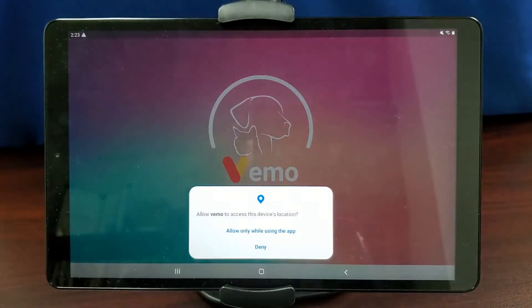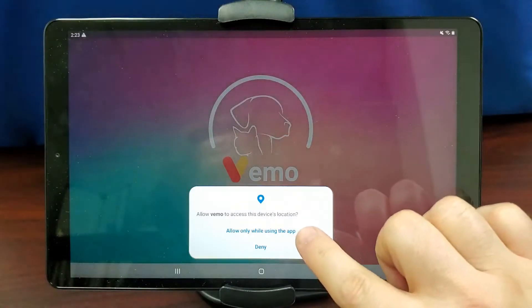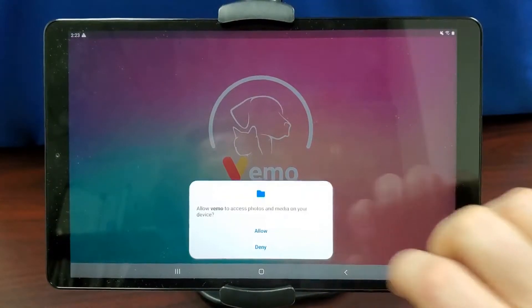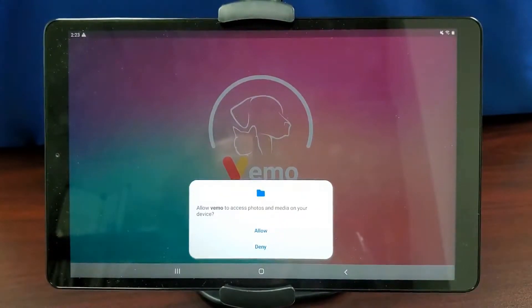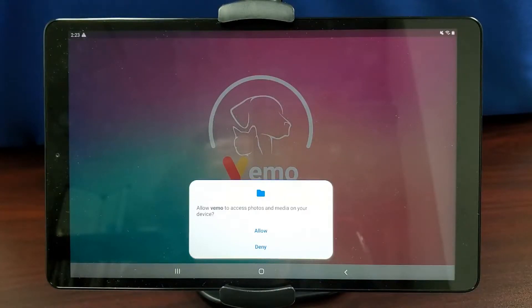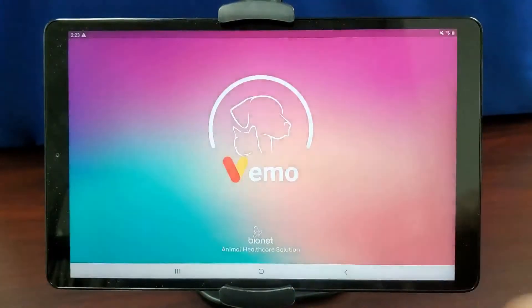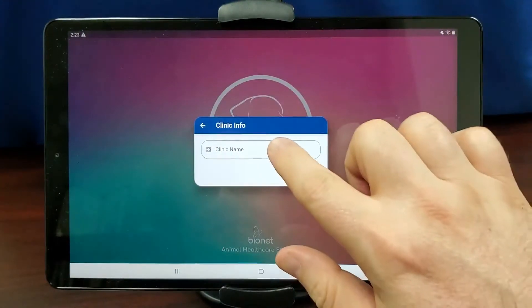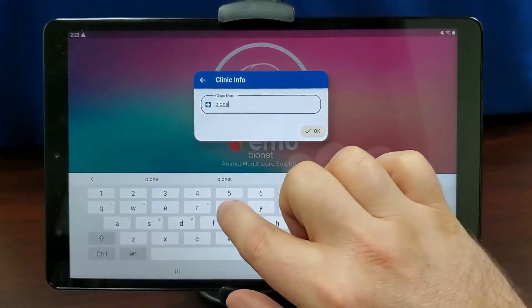Tap Allow only while using the app when you see the Allow Vemo to access this device's location message. Tap Allow when you see the Allow Vemo to access photos and media on your device message. Input your clinic name and tap OK.